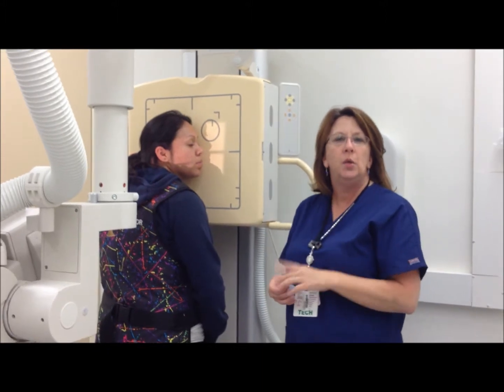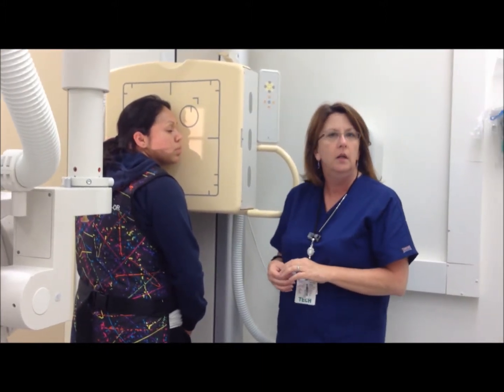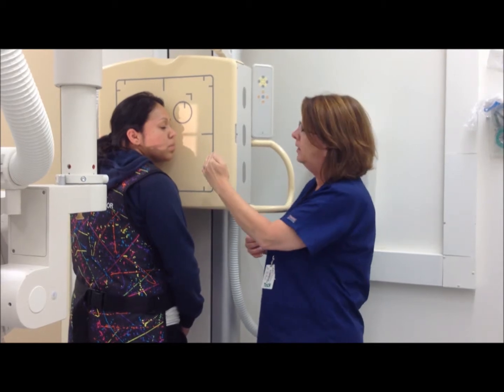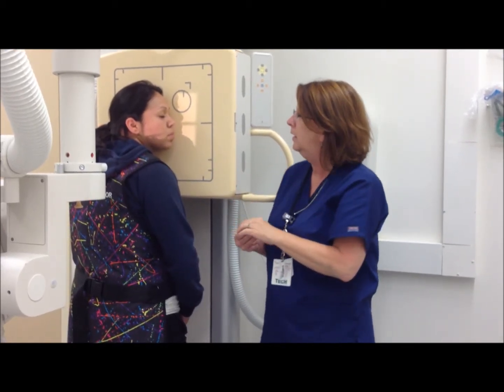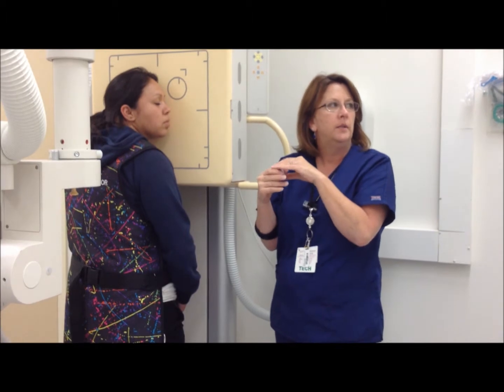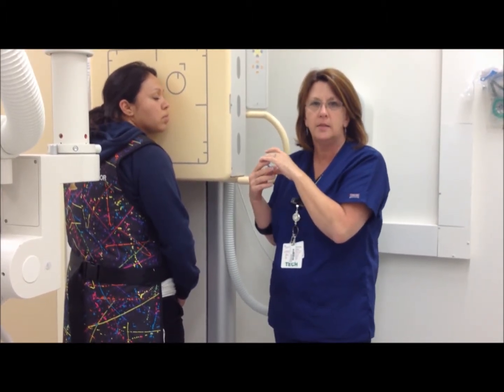Okay, so now we're going to do a left-sided axiolateral oblique, also showing the mandibular body. My CR will come in at the mandibular angle and exit the acanthion. Patient is 30 degrees off the mid-sagittal plane toward the IR. My technique is the same, 70 to 75 at 5 to 7 mAs.